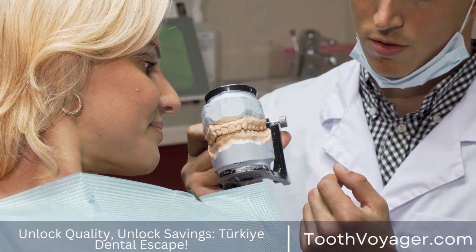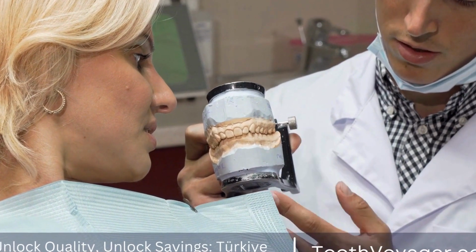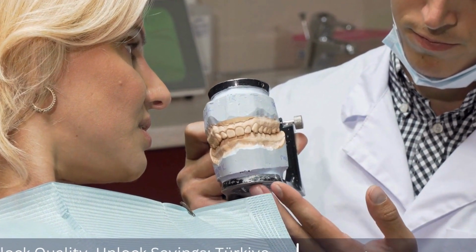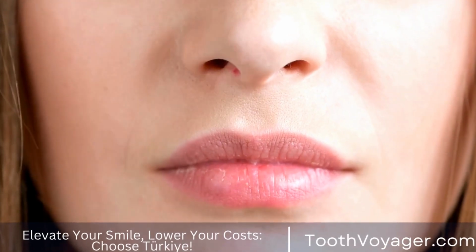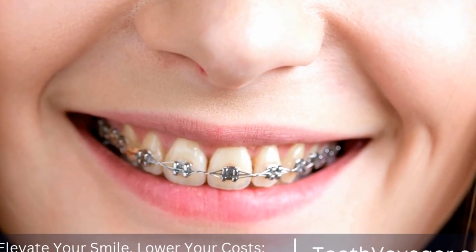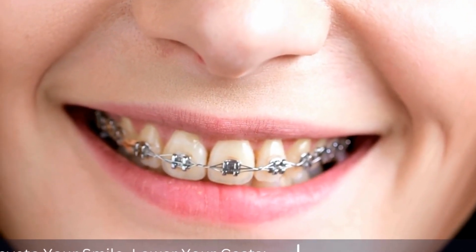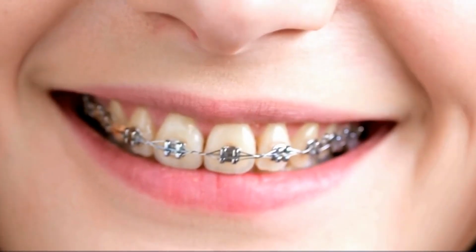If the patient is determined to be an appropriate patient for dental implants, the dentist creates an individualized treatment plan according to the patient's specific demands. The procedure may include taking x-rays of the patient's teeth, taking impressions and photographs of the patient's mouth as well as jawbone to confirm that implants are correctly placed for maximum function and appearance.